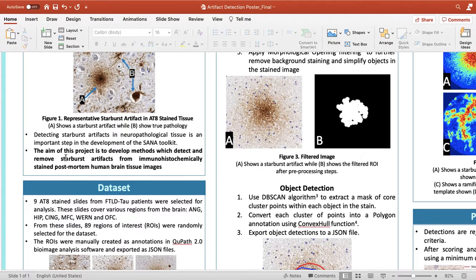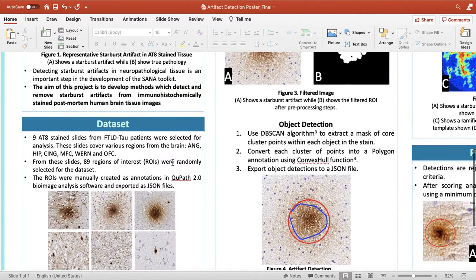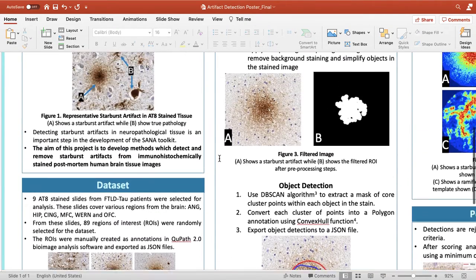Therefore, the aim of this project is to develop methods which detect and remove staining artifacts from our post-mortem human brain tissue images. As you can see here, our dataset included ROIs that have artifacts as well as representative ones that do not have artifacts.